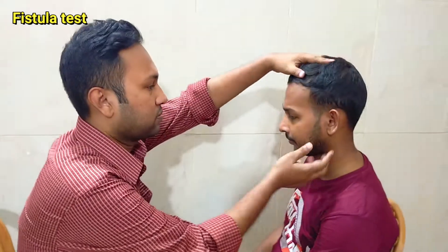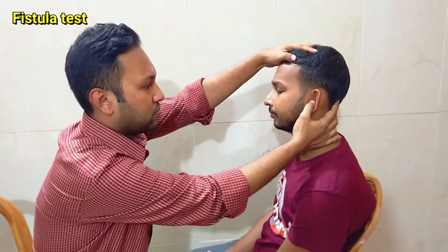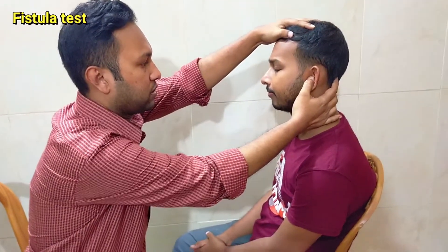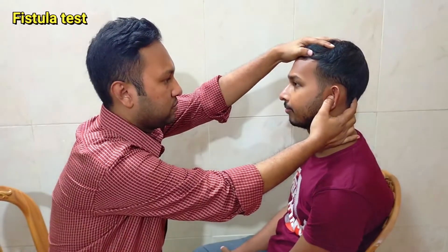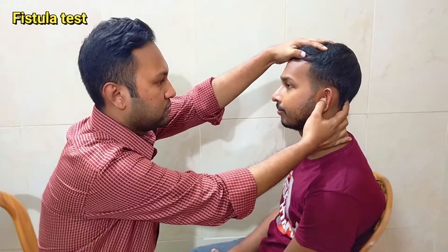Next we are going to perform the fistula test. First we have to explain to the patient what we are going to do. Then by pressing the tragus inward into the external auditory canal several times and occluding the external auditory canal with the tragus, we have to look for any nystagmus or any vertiginous feeling felt by the patient.